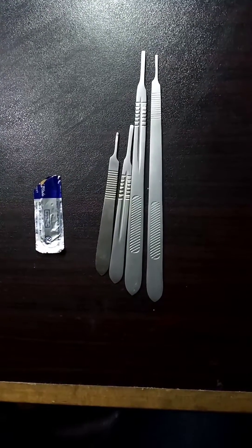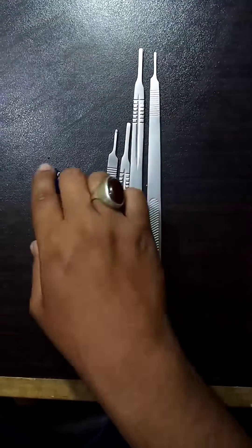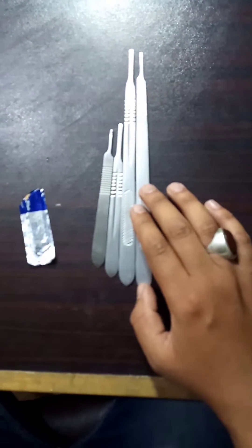Assalamualaikum, how are you all? Hope you are all fine. Today we are talking about scalpel handles and how to attach a blade on a scalpel handle. I have four scalpel handles here — four sizes of scalpel handles.